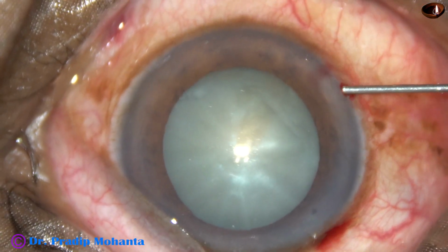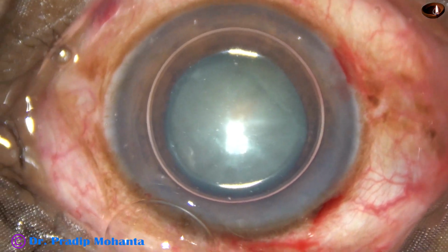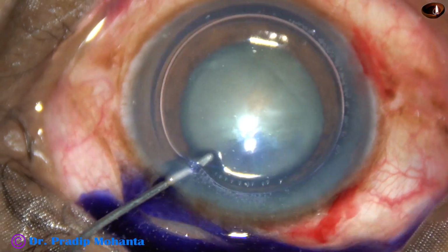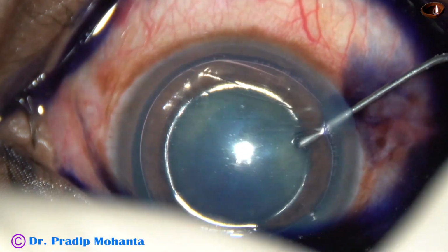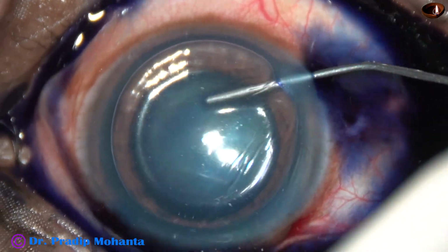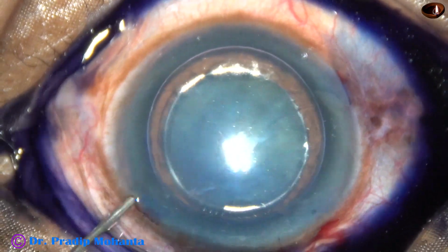Now my plan is to stain the anterior capsule of this white cataract with trypan blue dye. An air bubble has been injected, and the dye is injected. Care is taken to apply the dye over all parts of the anterior capsule. There should not be any unstained area. And then the dye is washed out.